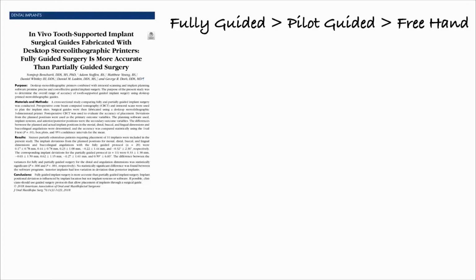From a technical perspective, from a surgical perspective, we have a lot of options right now, which is really an amazing time, obviously, to be in dentistry and implant surgery. We have the whole spectrum of skills that we can use in order to place dental implants. We have the ability, and I learned how to place implants freehand. We can do pilot guides. We can do fully guided implant surgery, which could be with a static surgical guide. It could be with a new dynamic navigation system.